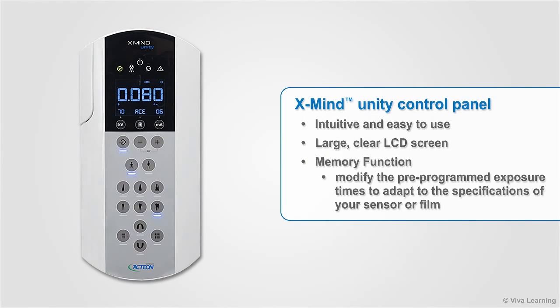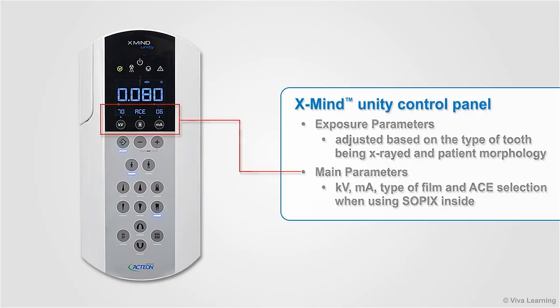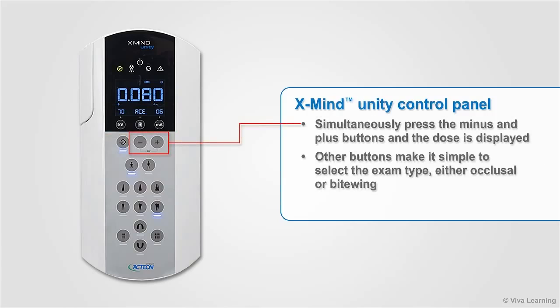The control panel of the XMIND Unity is intuitive and easy to use, with a large clear LCD screen that enables your team members to see the main parameters even when standing at a distance. The memory function lets you modify the preprogrammed exposure times to adapt to the specifications of your sensor or film. Exposure parameters are each adjusted based on the type of tooth being X-rayed and patient morphology. The main parameters — kilovolts, milliamps, type of film, and ACE selection when using Sopix inside — are all displayed. Simultaneously pressing the minus and plus buttons displays the dose as well. Other buttons make it simple to select the exam type, either occlusal or bitewing.